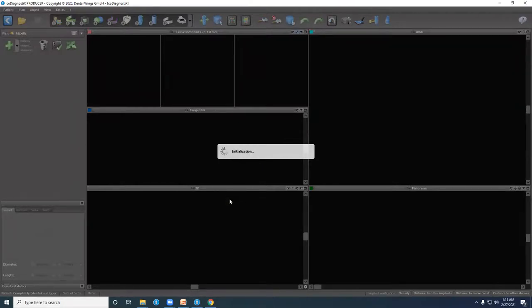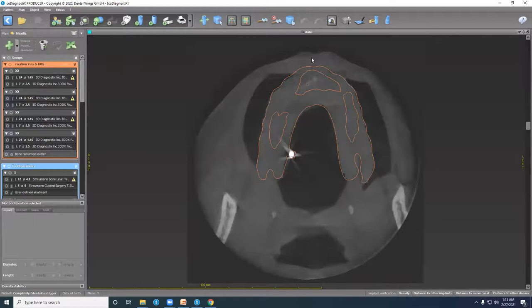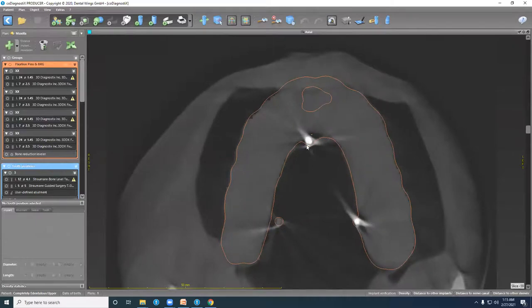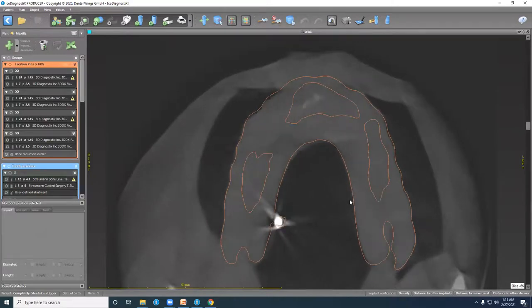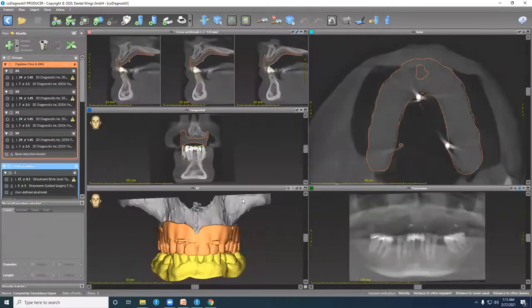This patient was scanned with an upper denture with the radiographic markers, as we see before. And let's walk through the dual scan on our CT. As you notice on the axial view, the markers are completely matching between the denture scan and the patient CT scan wearing the denture. And this means we can proceed forwards with a prosthetic-driven implant treatment plan.